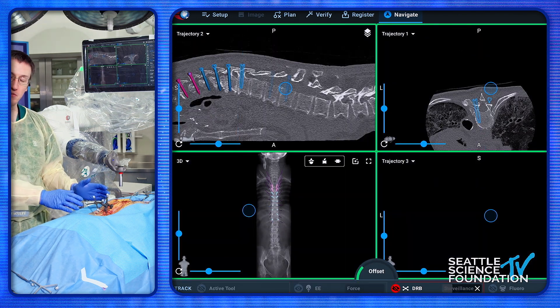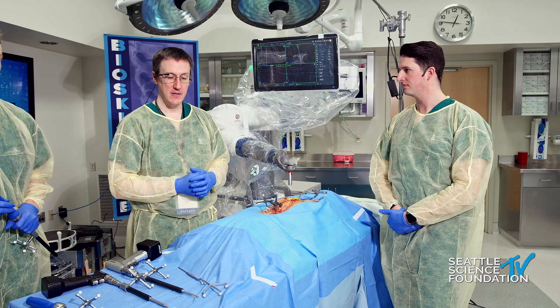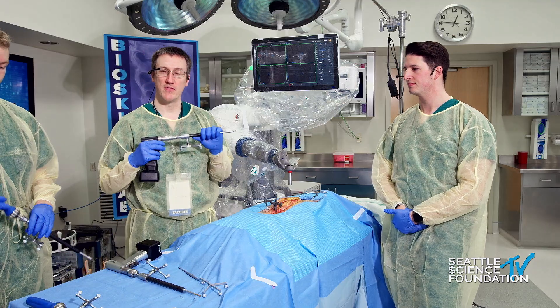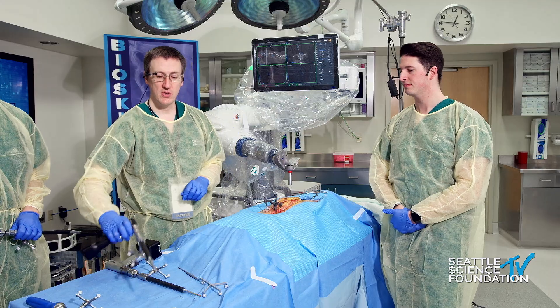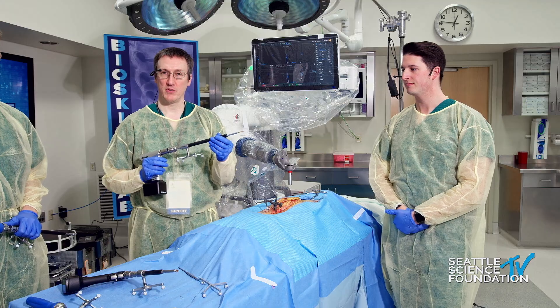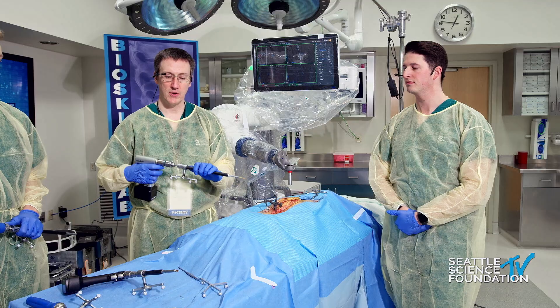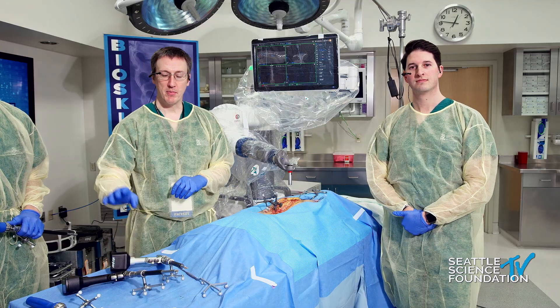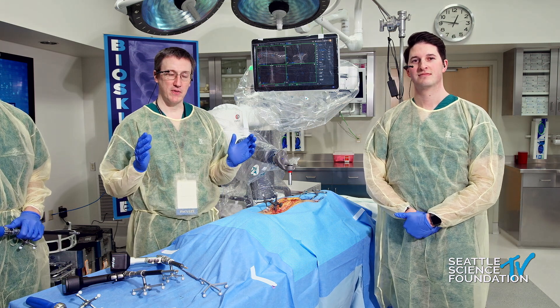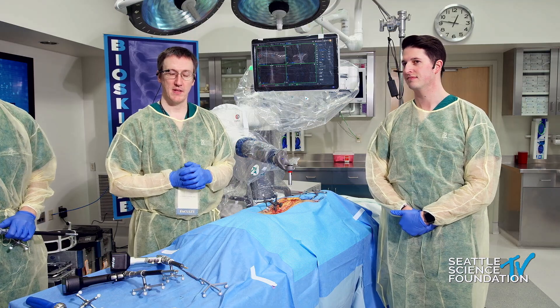That's really how I do it. Again, I think the key fundamentals are to make sure your reference array is visible to the camera the whole time, that you do your anatomy check, that you're very gentle, and that you use soft hands. This high-speed burr is a very helpful tool to make that initial divot. Having a flat-tip router-type bit is very helpful as well because it makes it difficult to push into the wrong direction — just let it gently go down. I'm a big fan of tapping, particularly as you get to the larger diameter screws. At any point if you feel you need to check a fluoroscopic image or use your ball tip probe, by all means do so.